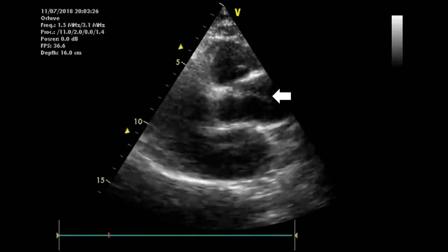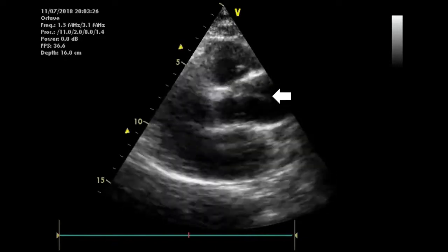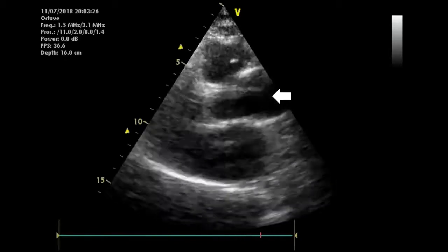This is what an intimal flap looks like on 2D ECHO, and sometimes placing color Doppler can help you distinguish the true aortic lumen, in which you can see color flow, from the false lumen, in which you don't see any color flow.